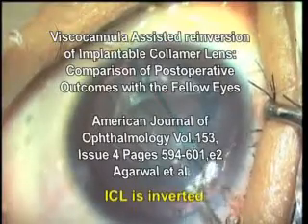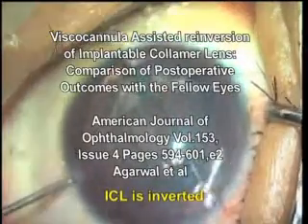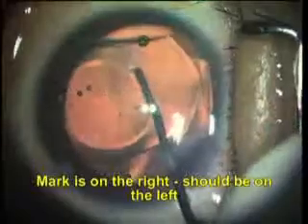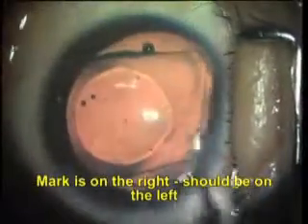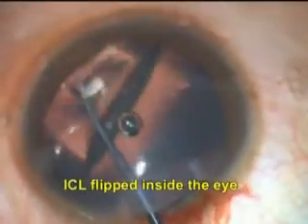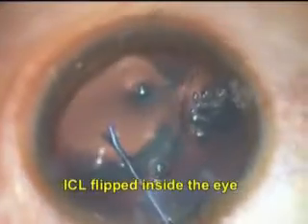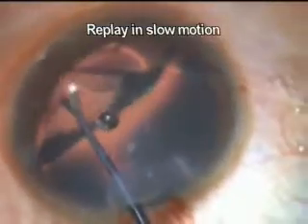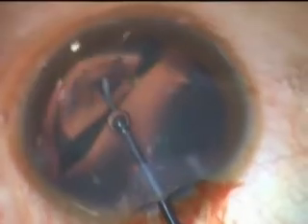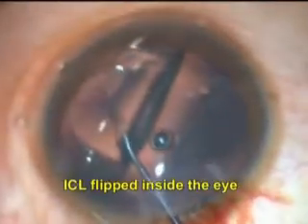So what does one do if faced with an inverted or flipped ICL? The ICL edge markings may be seen flipped. In experienced hands, it is possible to re-invert a flipped ICL. The ICL is rotated to make it lie horizontal and the edge lifted up with viscoelastic injected under it. It is then folded on itself so as to bring the convex side superiorly.